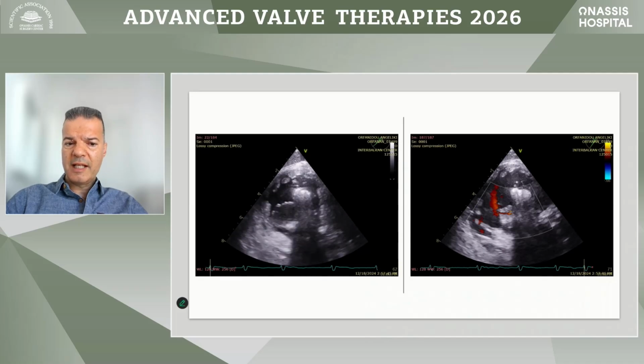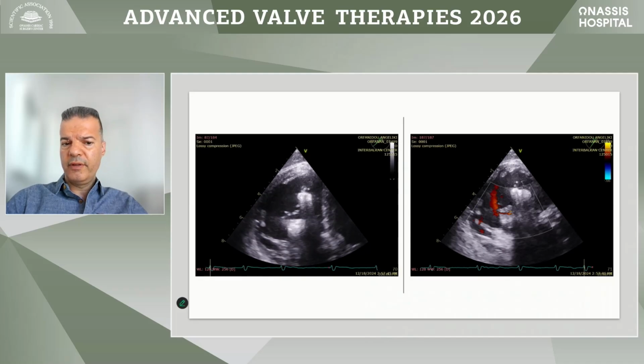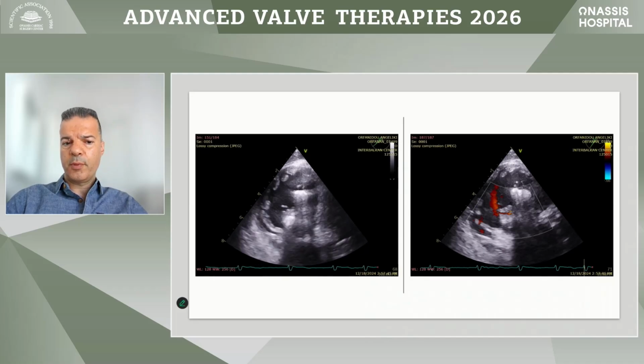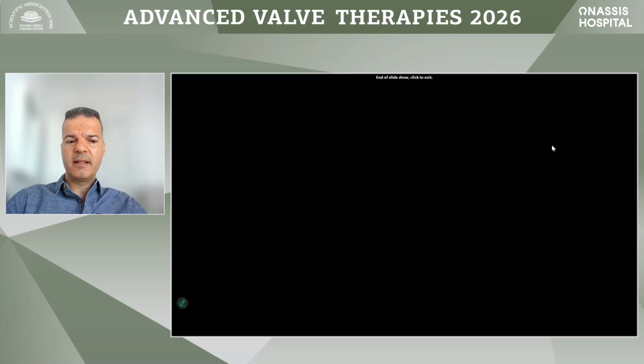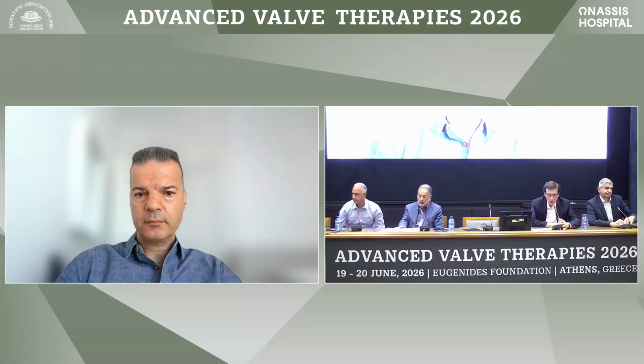This is a very interesting aspect. Look at both devices. One is anteroseptal, the other is posteroseptal. You can see both devices are moving almost independently to each other, following the motion of the leaflet. And this is something that we really like in these devices. So that is the end of my presentation. I'm very happy to take questions and discuss any issues.